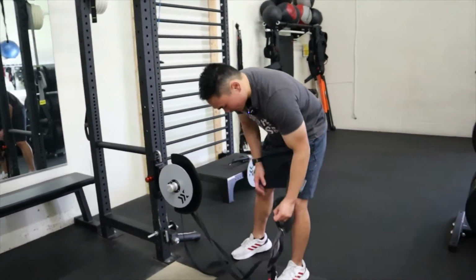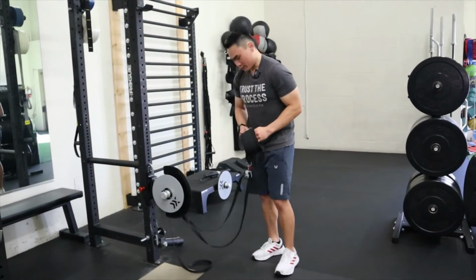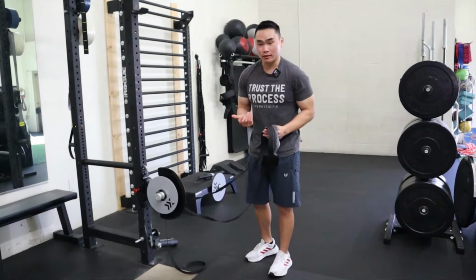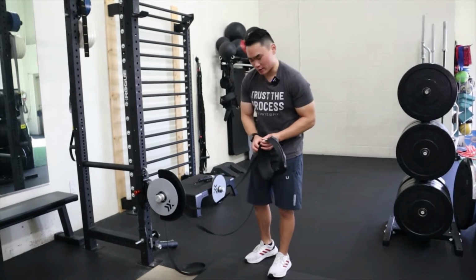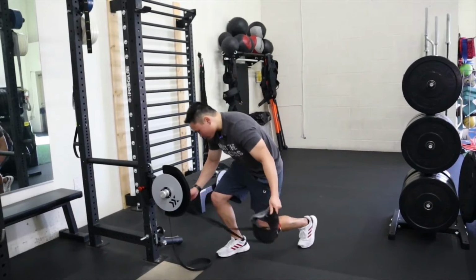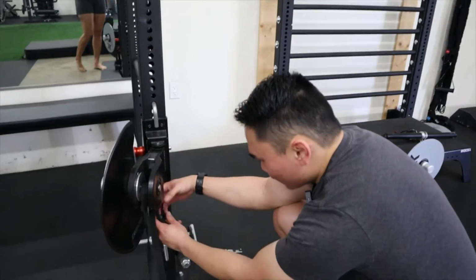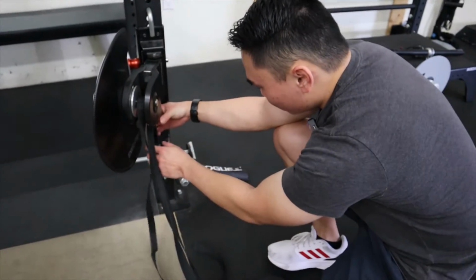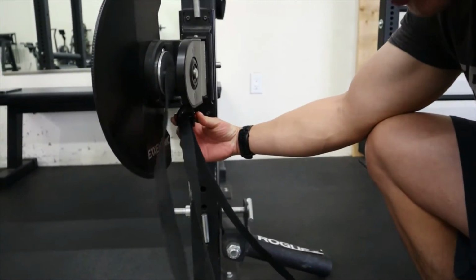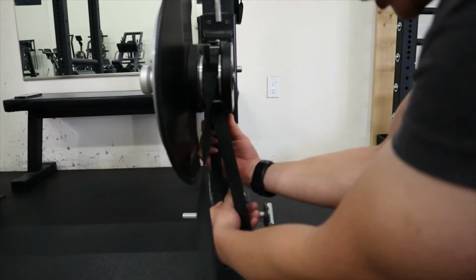And I have an exercise set up here that I like to do for a lot of my ACL patients, but this is more so for if you have a quad tendon issue or a quad tendon graft for an ACL. But I like to have patients lay prone and cuff. Oh wait, I didn't even show. To feed the rope, you use this little thing here, and you just push up on it, and you can either pull to make this thing shorter, or you can pull here to make it longer. So you can adjust that as needed.